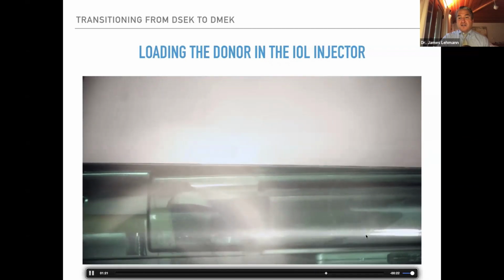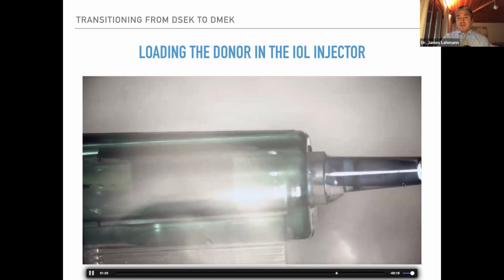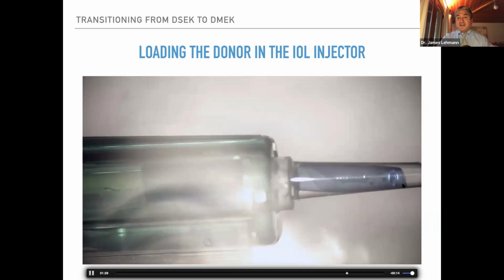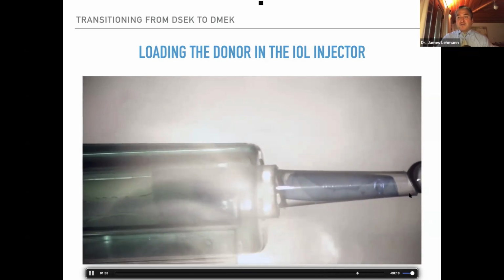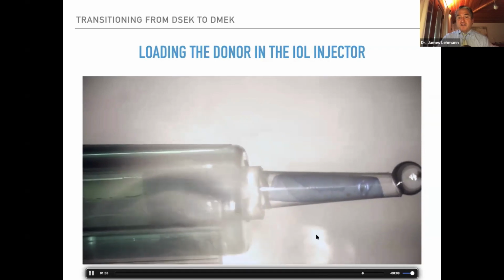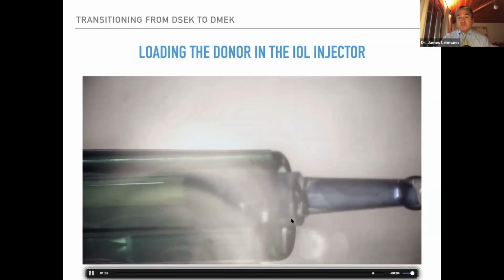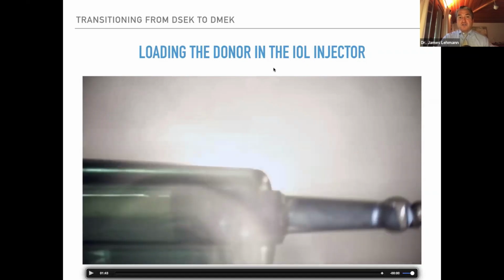All right, and then you're going to see it. That's the graft right there. Now, we don't want the graft to shoot out the end of the cartridge. So at this point, you have to start rotating the tip of the injector up and being real gentle so that fluid comes out of the end, but the graft doesn't. And then you have the graft safely loaded once the plunger hits this point right here. And then you're ready to inject it, okay? And we'll show some examples of that.